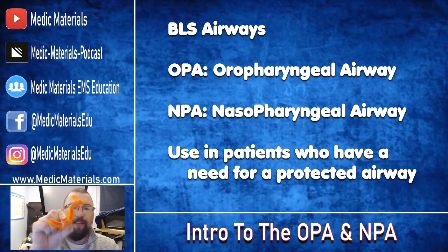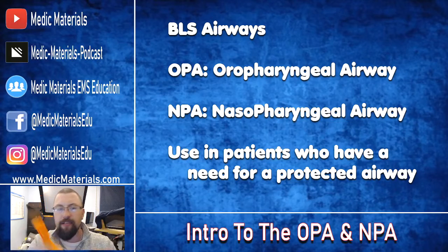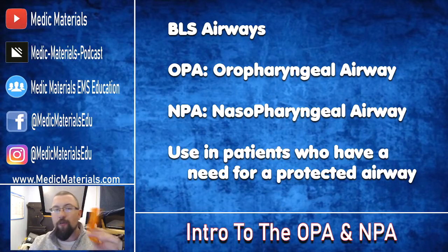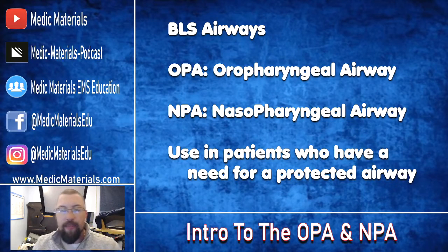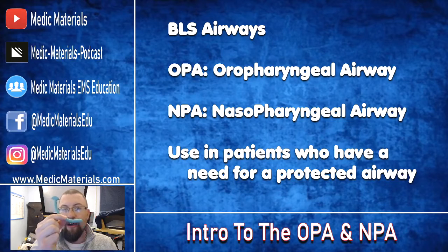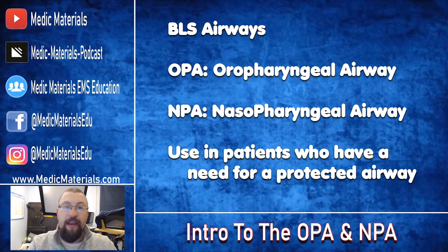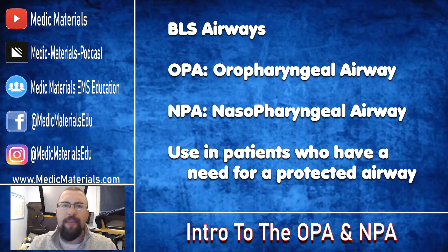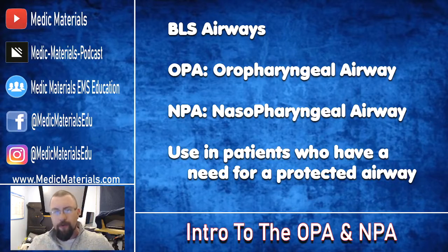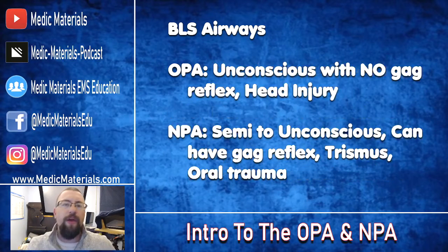The first one is the OPA — this little guy here. These come in sizes from infant all the way up to this one, which is the largest adult. OPA stands for oropharyngeal airway. The NPA, which is the rubber one, again comes in a multitude of different sizes, and that one is the nasopharyngeal airway. These airways are used in patients that need a protected airway.